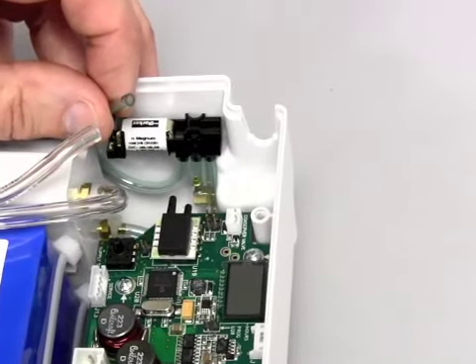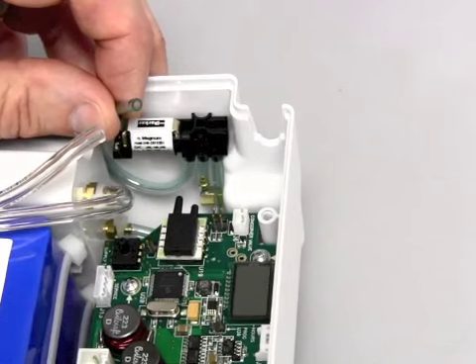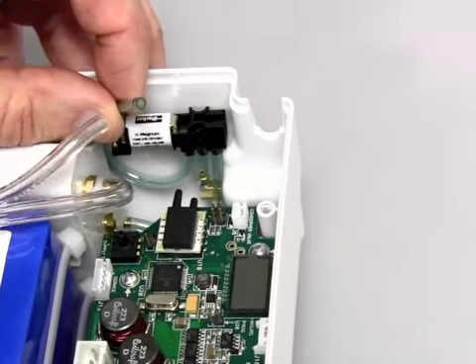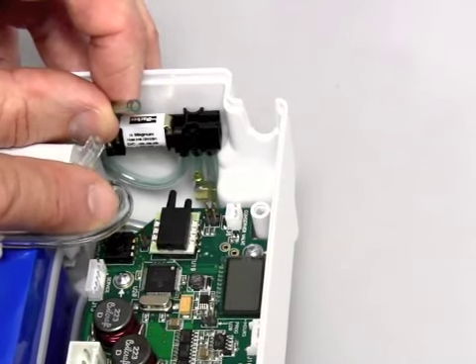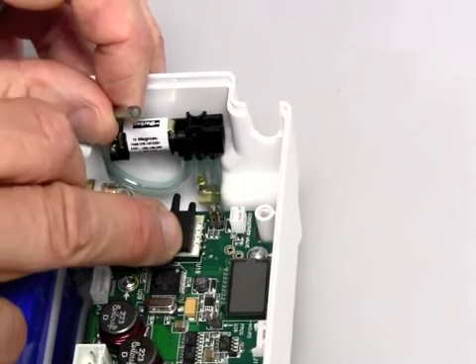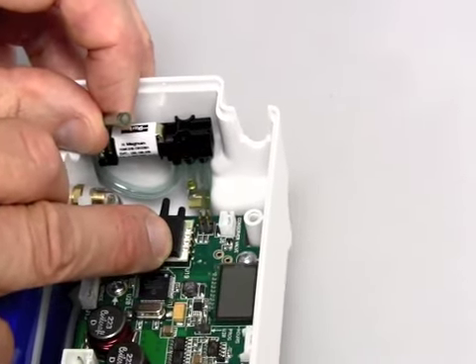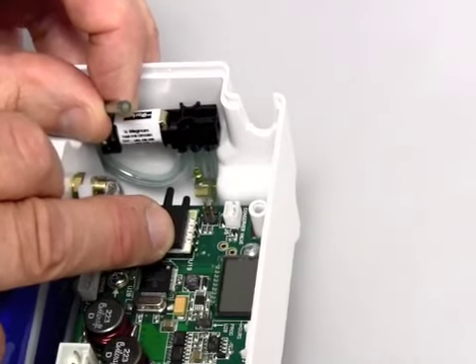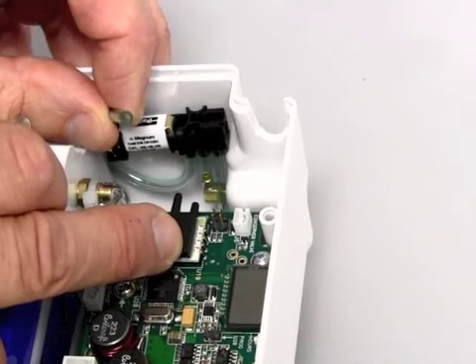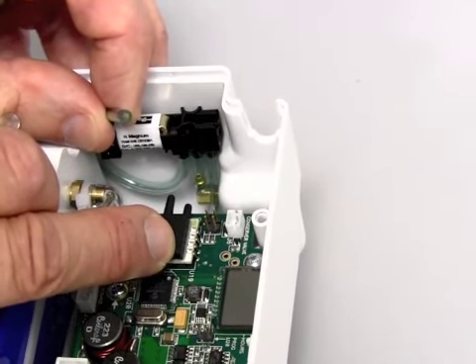The piece of Tygon that I have in my hand that comes off of the third barb off of the valve now gets plugged into the sensor on the circuit board. It goes onto the top port of the sensor, and please use caution when doing this. You want to hold the sensor when you push the Tygon onto that top barb. Also note that you will need to put a wire tie onto the Tygon before it's pressed onto the barb to hold it in place.